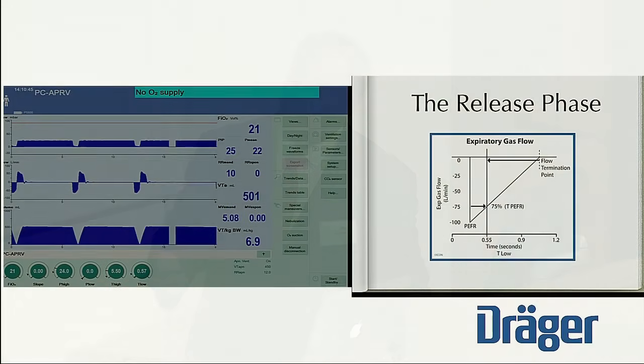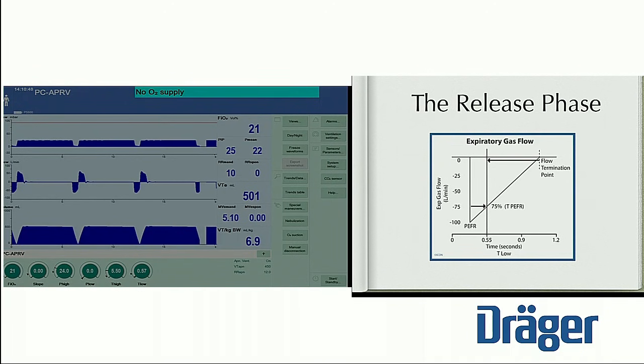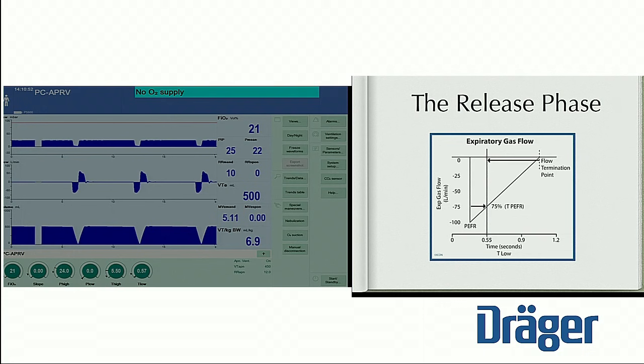You can see here it takes very little time — incremental change. In human beings, very small changes can result in dramatic potential for derecruitment. So this is one of the most important things about APRV: we set this to the flow pattern as opposed to a number. We want this particular flow pattern. What she's done is increase the time low, and you can see the inflection point where the flow truncates and goes back up — you've let more air out of the lung.